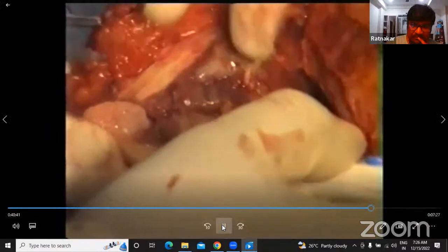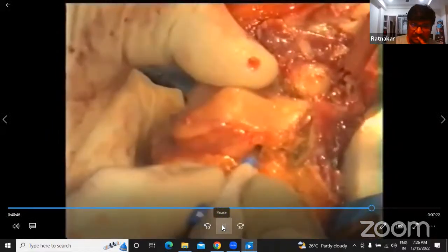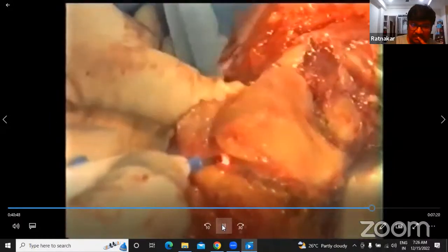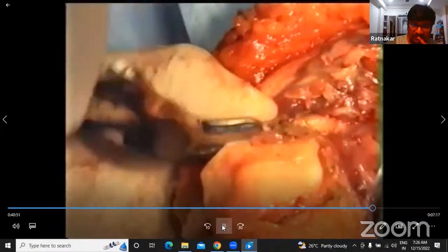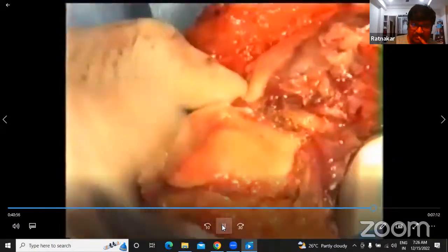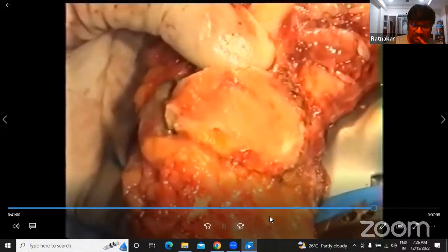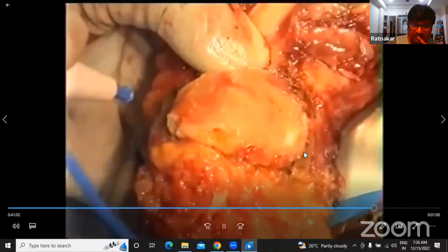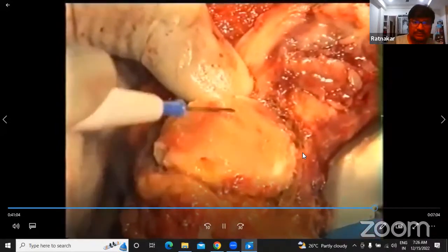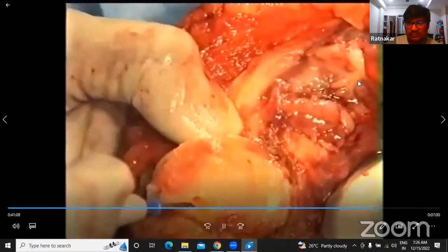Okay. Basically, circumcision of the patella. Now the patella is round, we have cleared all the osteophytes and circumcised. And in fact, the patella is very well preserved in this case.